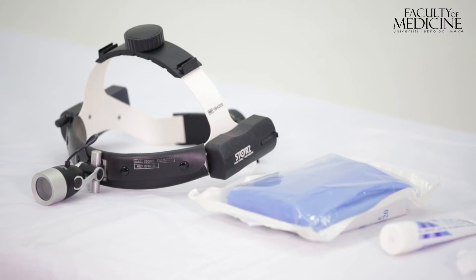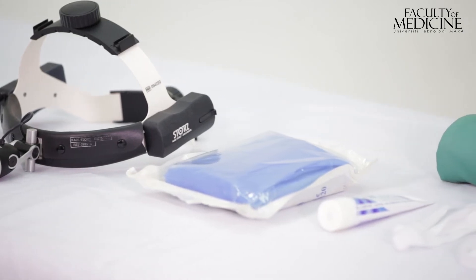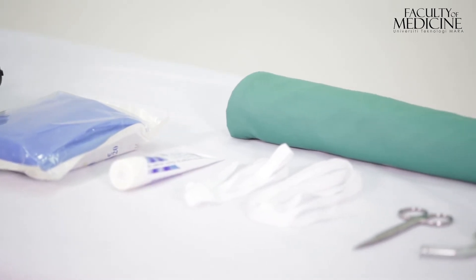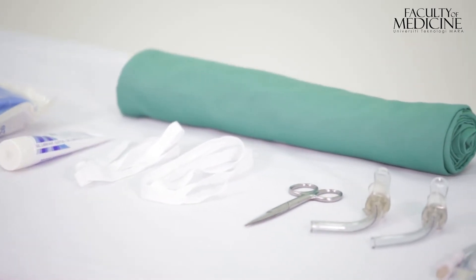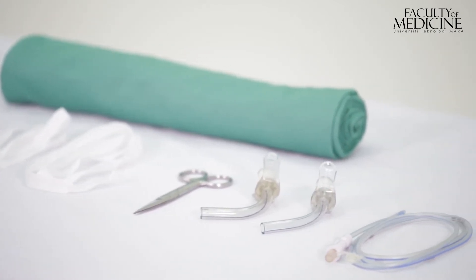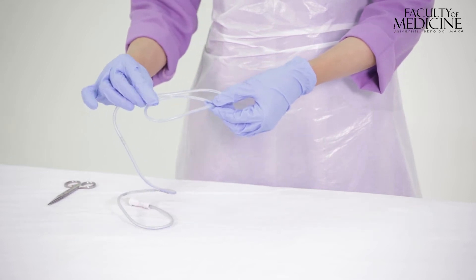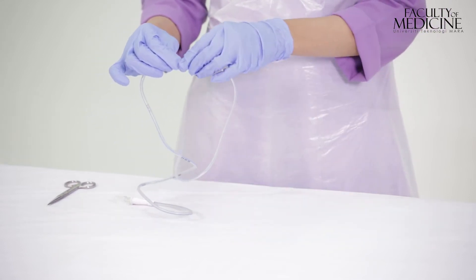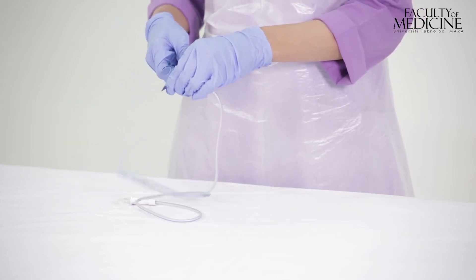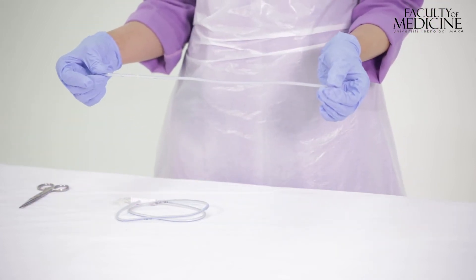The equipment needed for a tracheostomy tube change using the Seldinger method includes a good light source, dressing set, lubrication jelly, spare ribbon ties, scissors or blade, two tracheostomy tubes of different sizes — one at least half or one size smaller than the original size — a nasogastric tube, and a sandbag. The nasogastric tube length is measured at least three lengths of the tracheostomy tube before it is cut. This will act as the introducer.